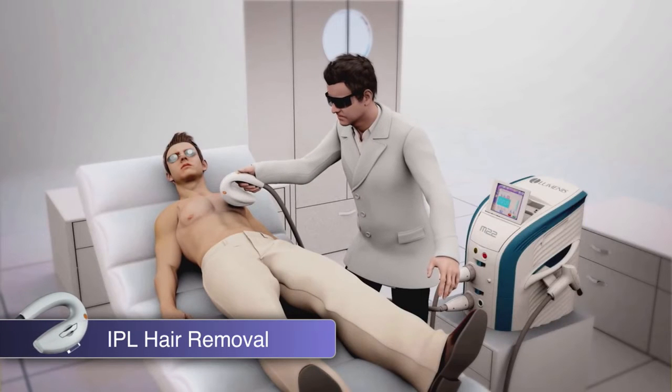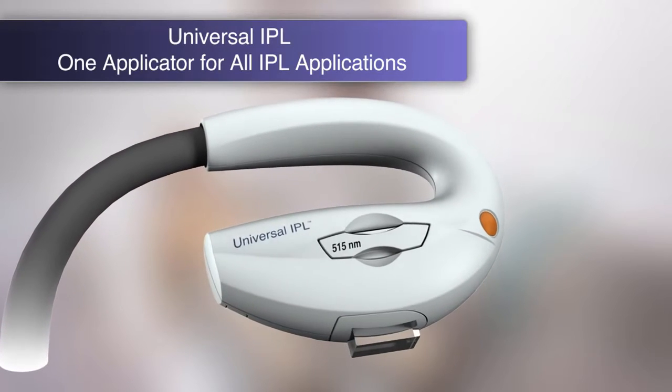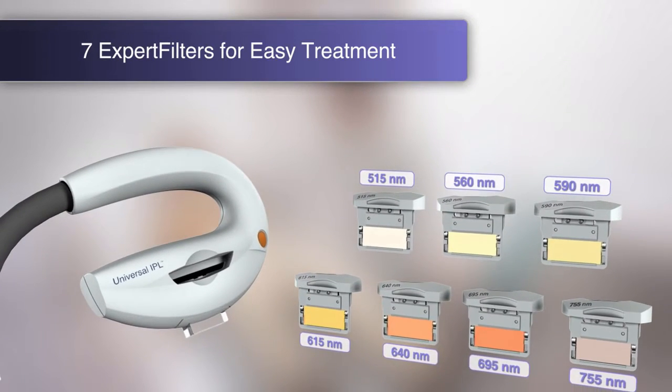The Universal IPL module treats more than 23 indications with a single versatile handpiece. The M22 Universal IPL handpiece has seven expert filters you can quickly swap. This saves treatment time and is cost effective.